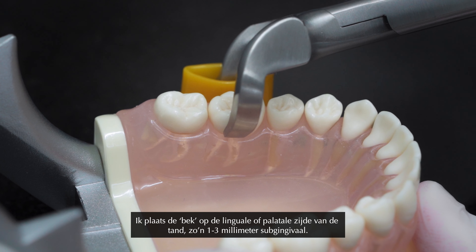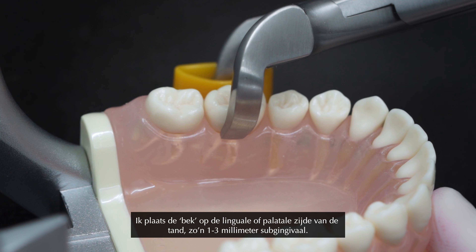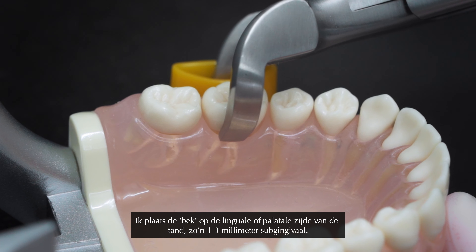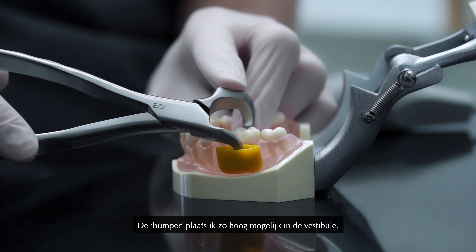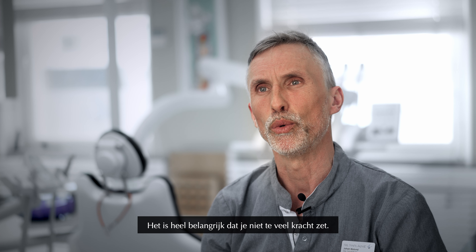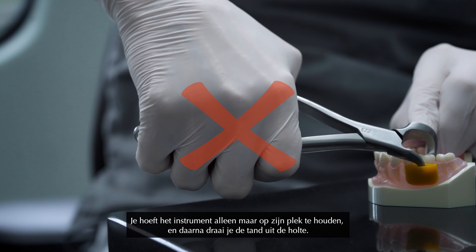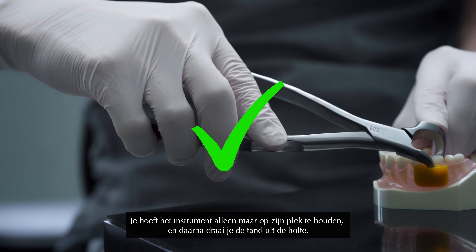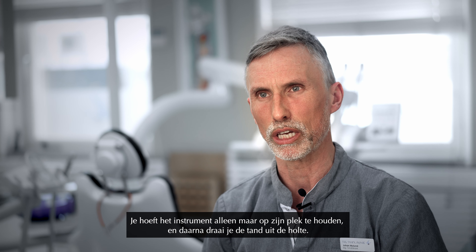I apply the beak on the lingual or the palatal side of the tooth, one, two, three millimeters subgingival. The bumper I place as high up in the vestibulum as possible. It's very important that you don't apply large force. You simply apply as much force for the instrument to keep in place and then you rotate the tooth out of the socket.